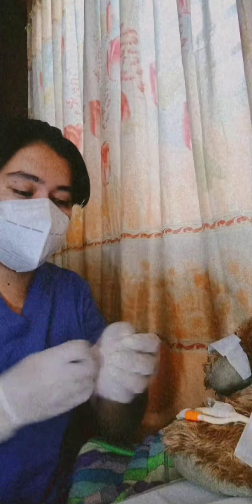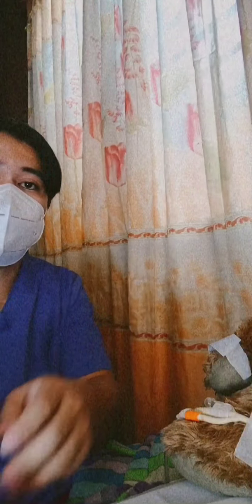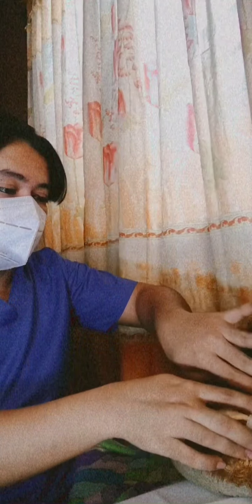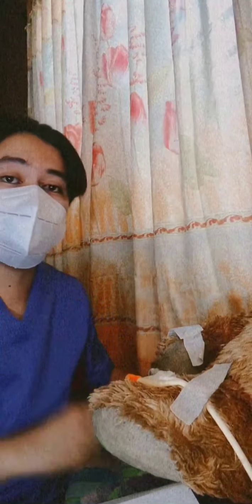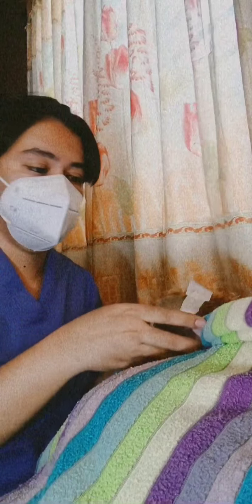Next, we're going to remove our gloves, and then secure the tubing by anchoring it on the inner thigh of the patient, and then place the patient in a comfortable position, and then drape him using a bed linen to give him or her privacy.